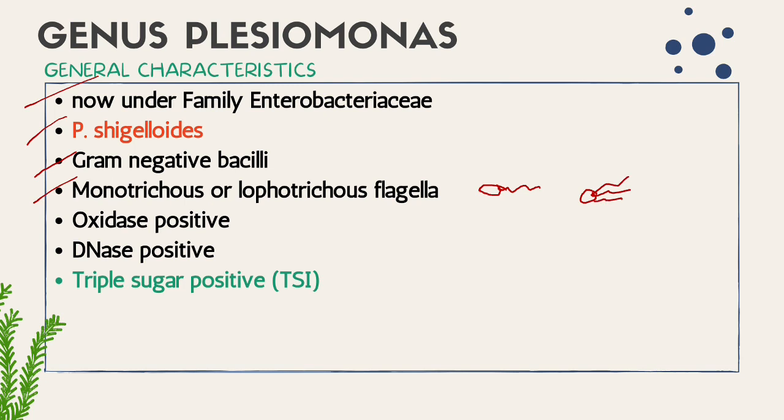This is oxidase positive just like your Vibrio, and DNase is positive. So this is what distinguishes it. As well as TSI positive.